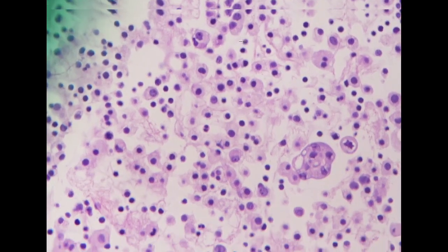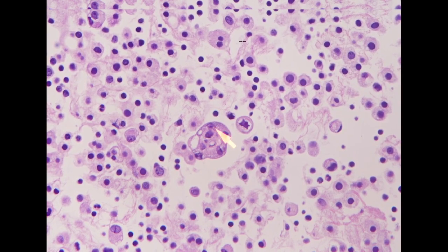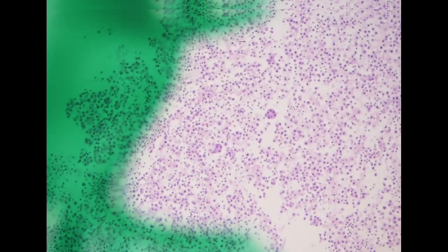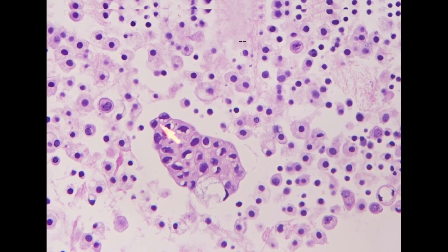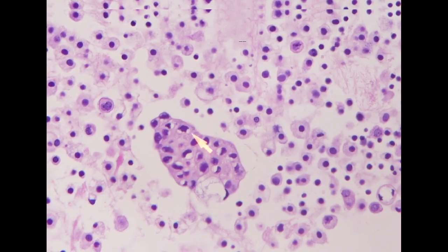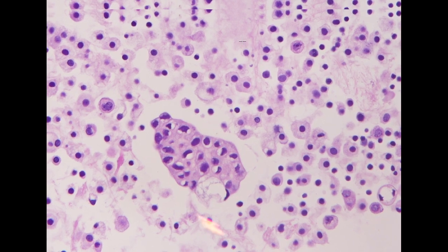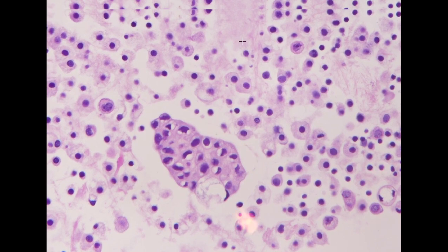The nuclear atypia here is very similar to the first cluster that we saw. It's quite obvious. So there were a few clusters with relatively irregular nuclear contours, a three-dimensional cluster, and peripheral traction artifact.